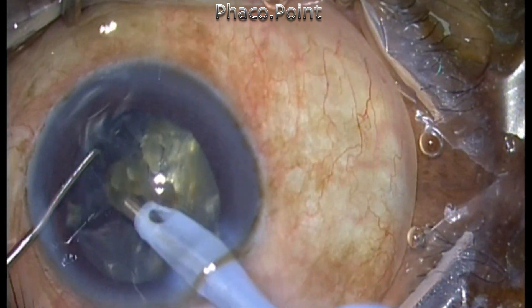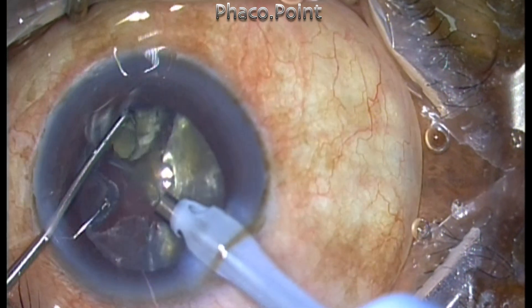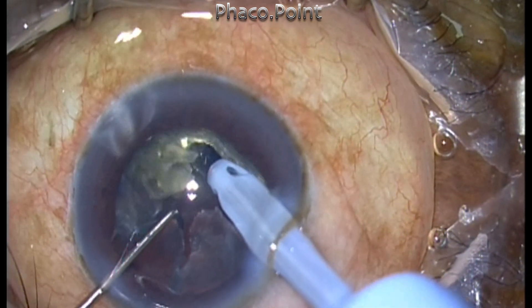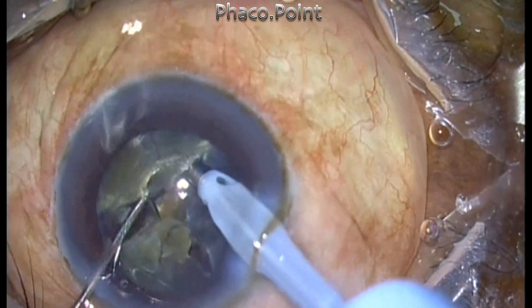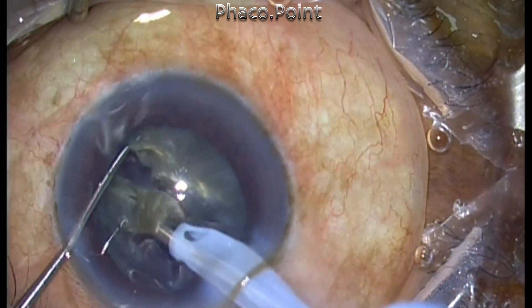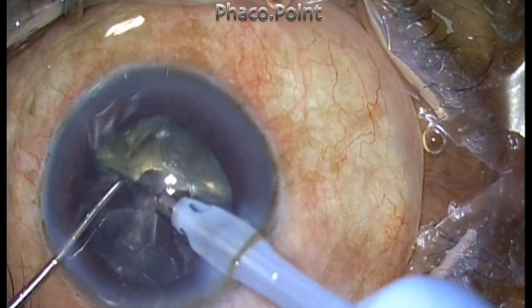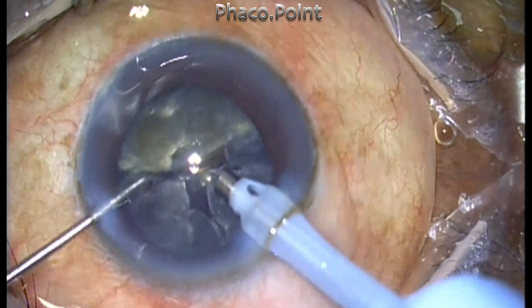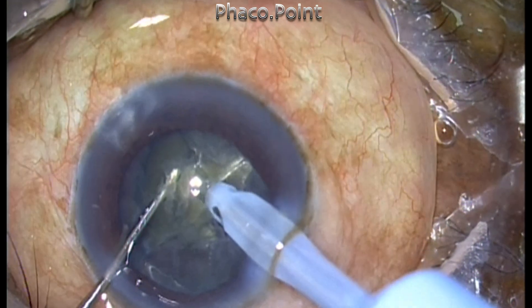This will ensure that you don't have a lot of flying fragment pieces in the anterior chamber — the anterior chamber will be clear and free of small flying shrapnel of nuclear fragments. Each of the four fragments is further downsized into two more fragments, so totally we get about eight fragments.